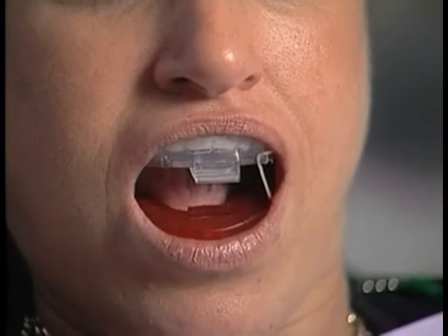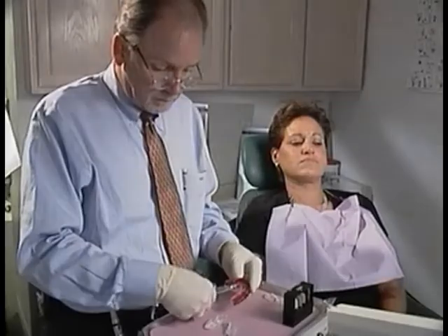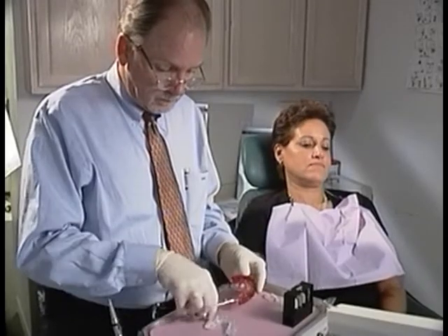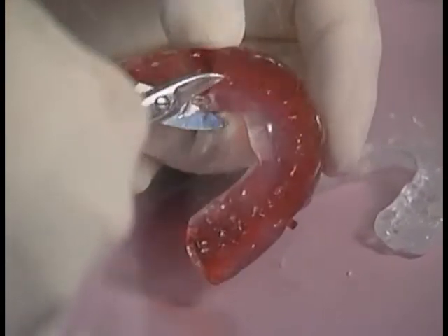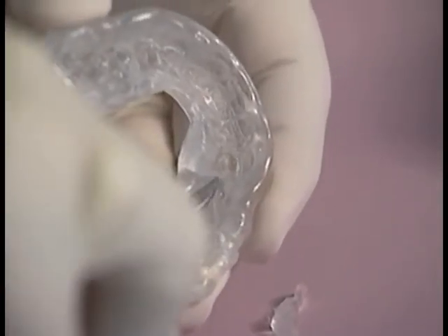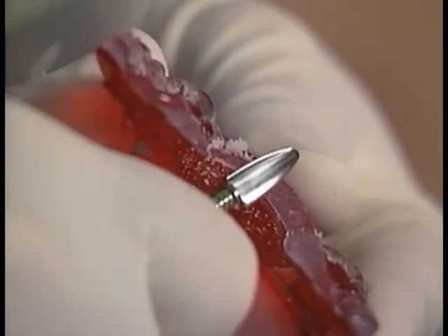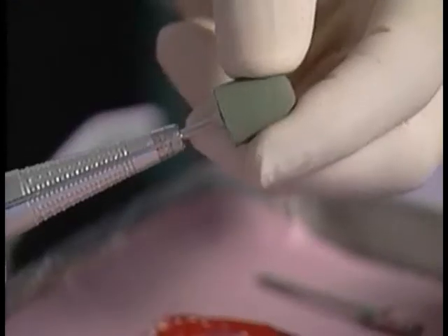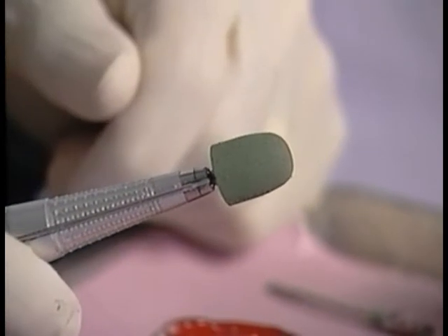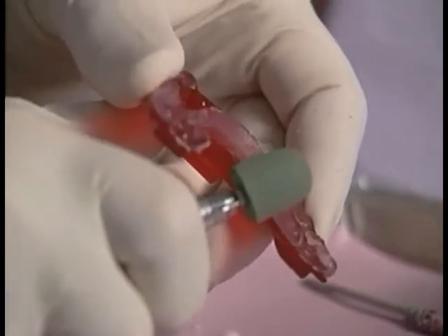If the upper and lower components remain in place while the patient opens and closes, it's time to move on to the finishing process. The finishing process ensures maximum comfort and fit. Using a pair of curved trimming scissors, cut away the excess material protruding over the edges of the trays. Complete the trimming process using the carbide burr from the NORAD finishing kit in a slow-speed handpiece. Next, use the three universal polishers from the kit, starting with the coarse green polisher, followed by the medium black, and finally the fine yellow polisher.